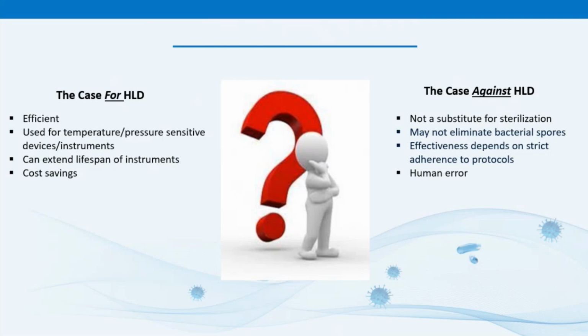Now, the arguments against HLD are backed by key players in the field, including the CDC and AAMI, the Association for the Advancement of Medical Instrumentation. Sterilization methods like steam, ETO, ethylene oxide gas, and forms of vaporized hydrogen peroxide can eliminate all forms of microbial life, including those hardy bacterial spores. HLD, however, while we know it's effective against a broad spectrum of microorganisms, might not reliably eliminate all bacterial spores.